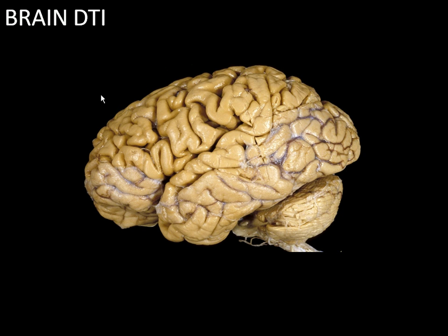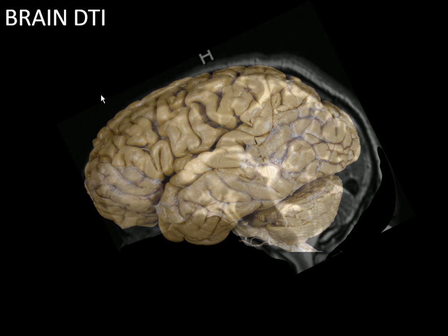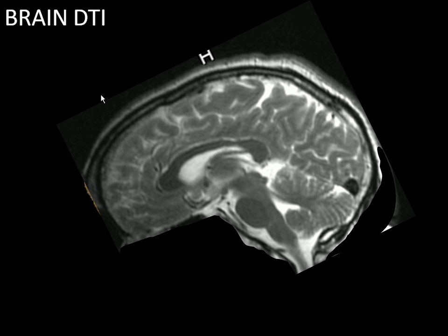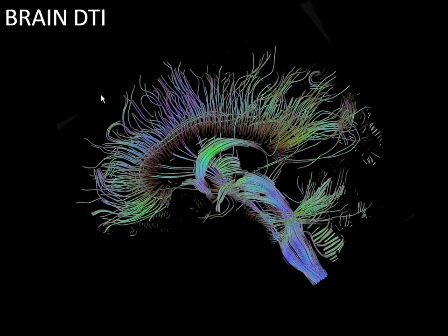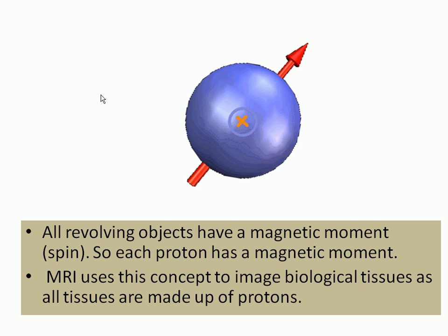The real application of diffusion tensor imaging came in the brain, where rather than seeing from outside, as the ordinary MRI looks at it like this, the DTI actually looks at the individual fibers in the brain. This is now a well established technology in the brain, and it is very well reported in many diseases. Now what is the difference between DTI and MRI?